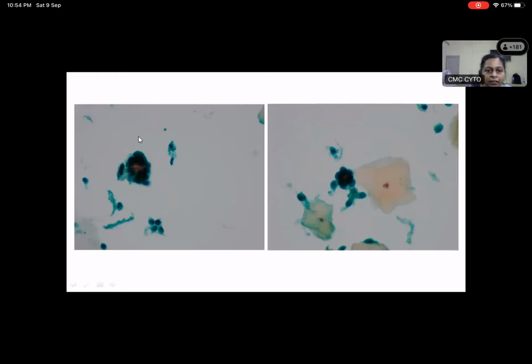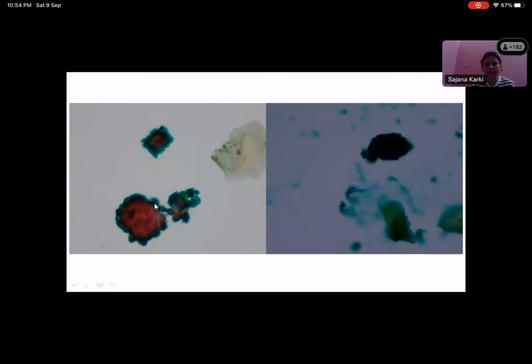Okay. So again, you can see that these are very dark clusters. So what kind of contour is this? Outer one is the glandular one and the inner one is the stromal cells. Okay, so inside this exodus ball, these are the stromal cells and you see a layer of glandular epithelium. This just looks very dark. You really cannot make out any glandular component or stromal component. Sometimes with endometrial cells, this is all you can see in real life. When you're looking at it under the microscope, this is probably how much you can make out.